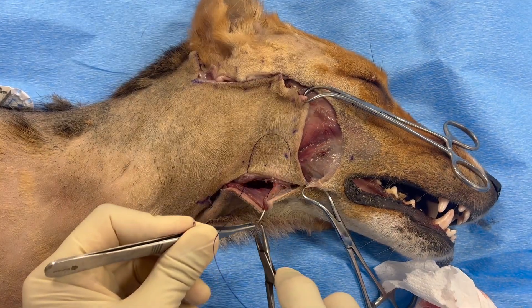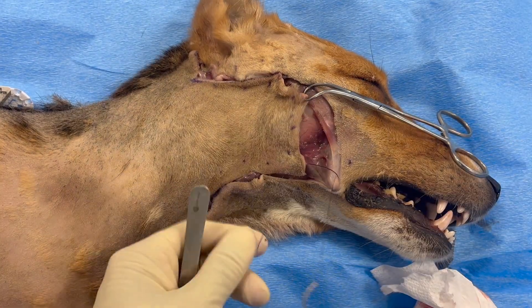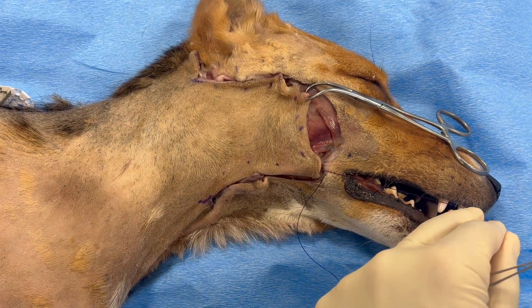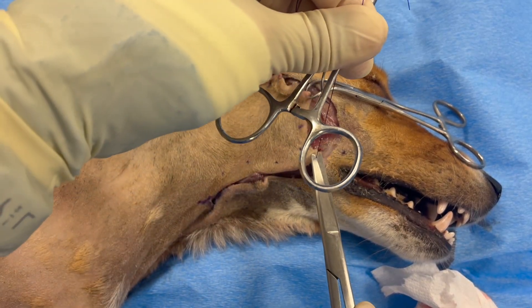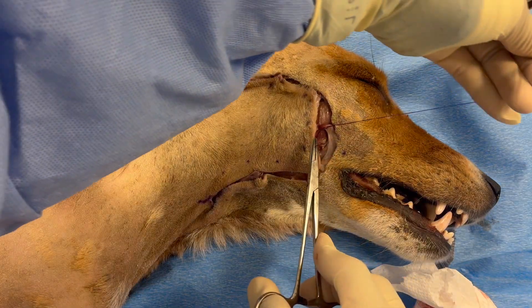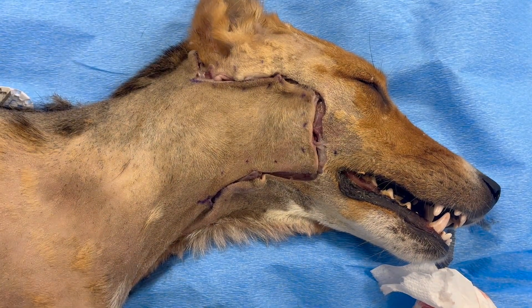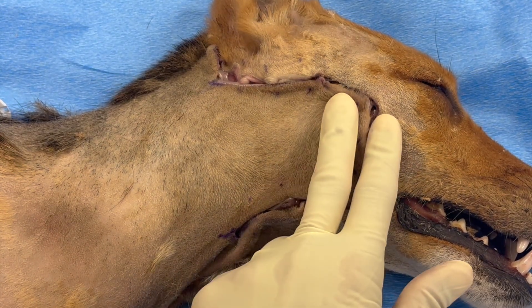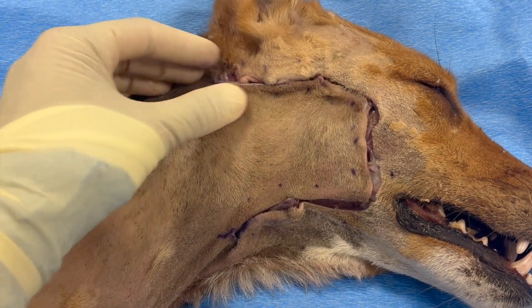I like to start from the base where there is lower risk of dehiscence and then gradually keep pulling that flap forward. If we've done this properly, we can see that the cranial-most — actually the most distal aspect of the closure flap — should be relatively tension free.